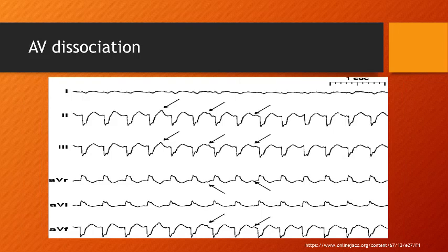Okay, another characteristic is AV dissociation. Whenever AV dissociation is identified on ECG, it largely establishes the diagnosis of VT. It cannot be seen in every case of VT, but whenever it is seen, you can say it is pathognomonic of ventricular tachycardia. It is characterized by atrial activity that is independent of the ventricular activity, usually with the ventricular rate exceeding the atrial rate, except in instances of a double tachycardia, for example, where there is a concurrent atrial flutter and a VT.